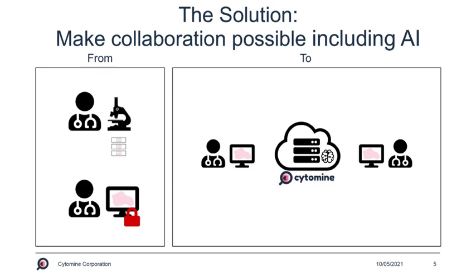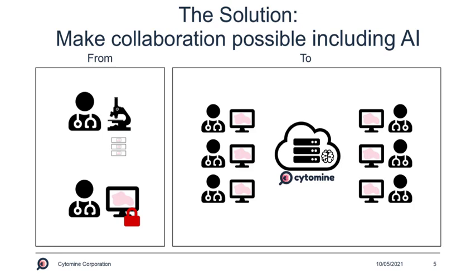That was the idea that drove the development of Cytomine since 2010: to move all the technology from the computers of the pathologists to web servers and to develop a full web application to share but also to annotate whole slide images over the web. Using Cytomine, pathologists are able to work fully remotely at any time from anywhere.